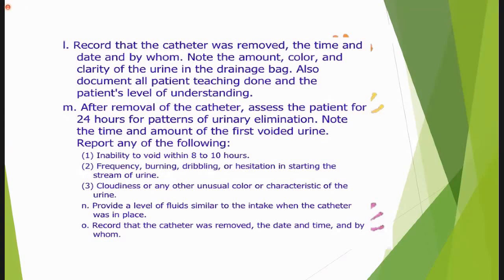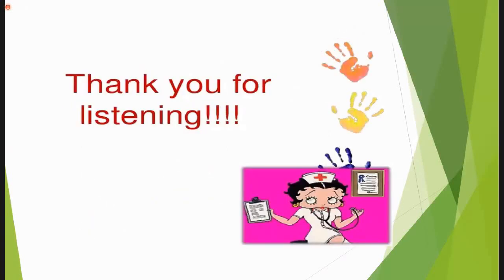Provide a level of fluid intake similar to the intake when the catheter was in place. Record that the catheter was removed, date and time, by the nurse. Okay, now I will play the video.